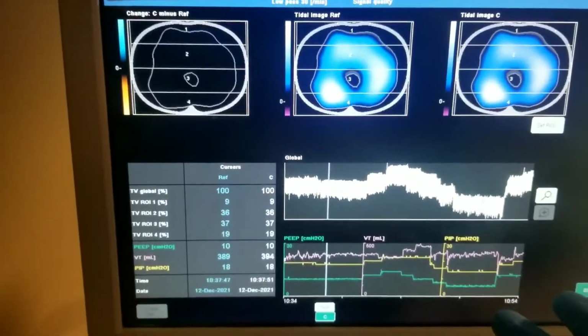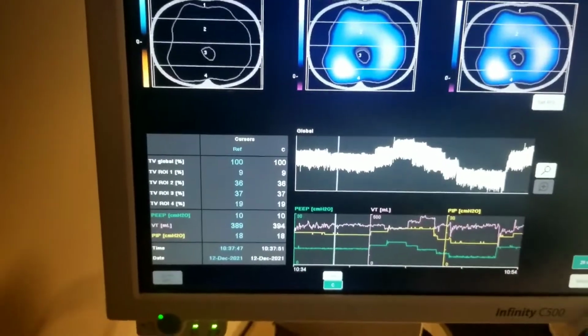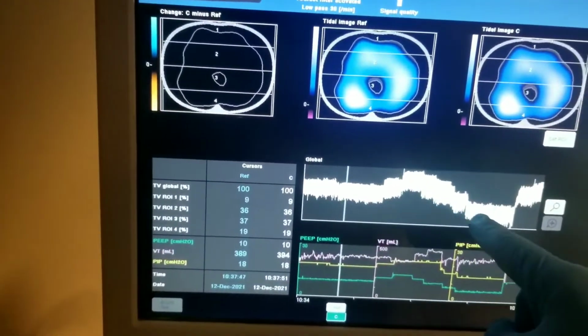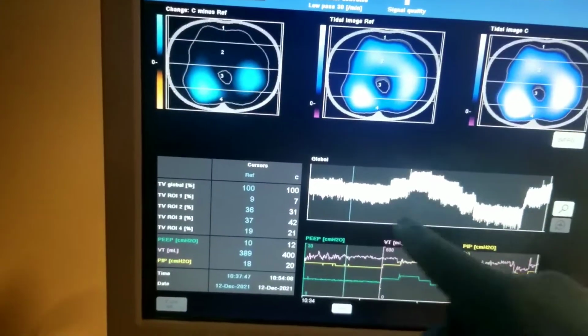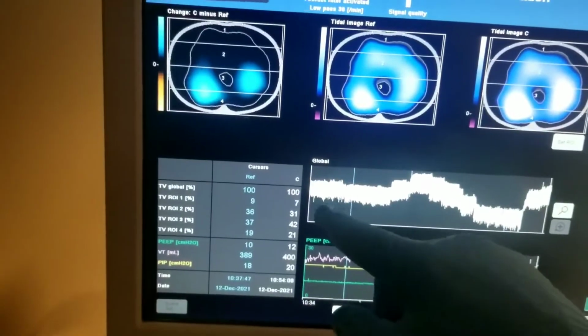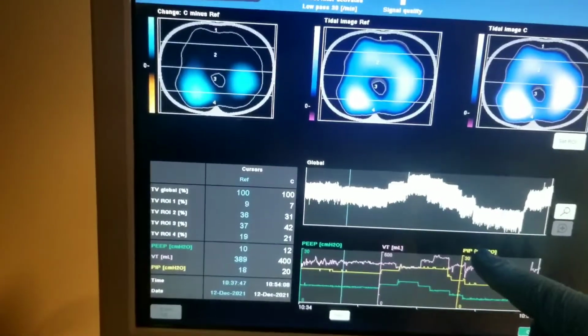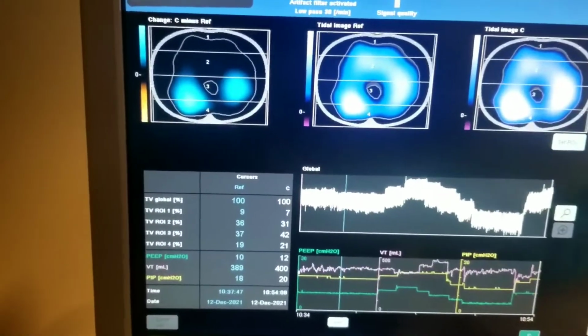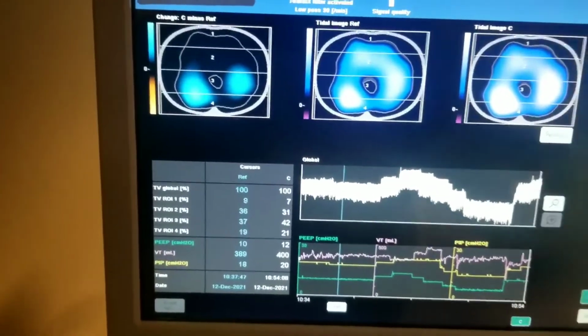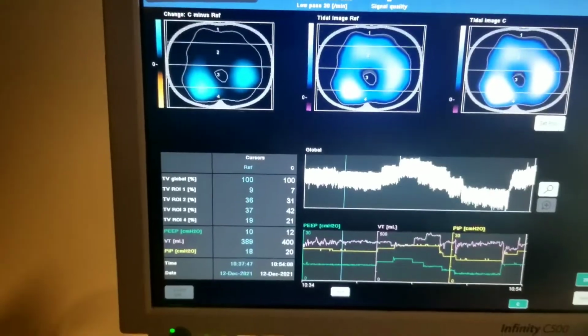So impedance overall is equivalent to volume. So underneath here would be kind of the functional residual capacity. Under this impedance curve represents the end expiratory volume quickly. And we can go to the next screen to go into more detail of the end expiratory volume. That's the other diagnostic screen that we can use.